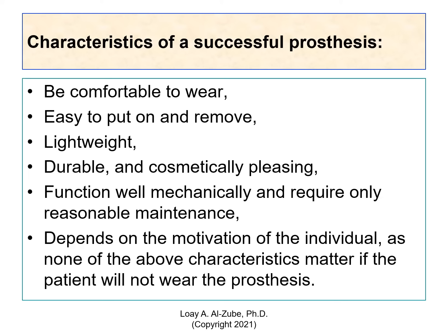After the surgery, usually the stump will swell, and it will actually take months to go back to a shape that is stable. And that's why we have a temporary prosthesis and then a definite prosthesis. The definite one is the one after the stump has formed and shaped. And remember, the surgery is also another thing, because surgeons can do something called running sutures or separate sutures, and that affects the shape of the stump.